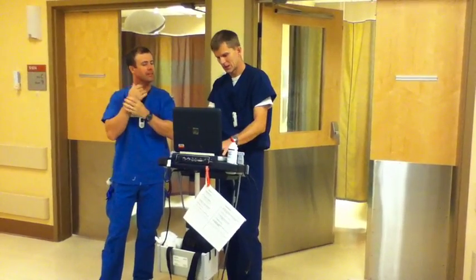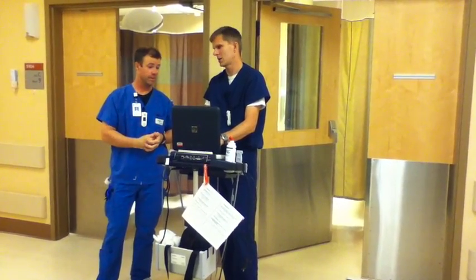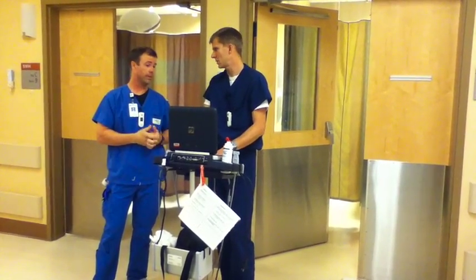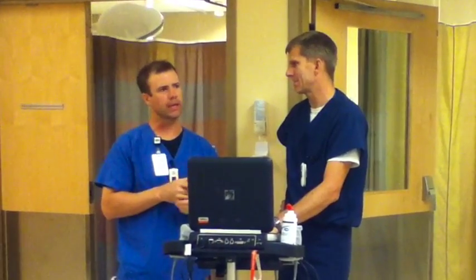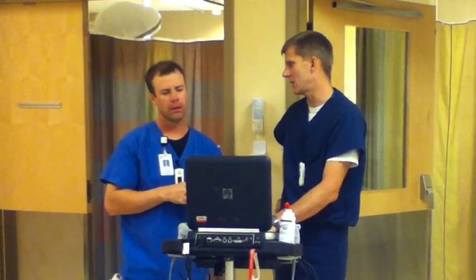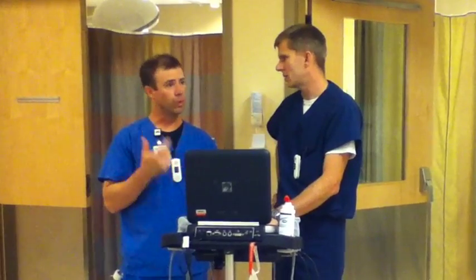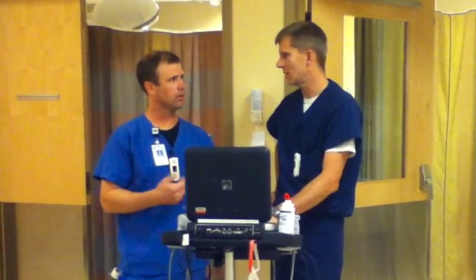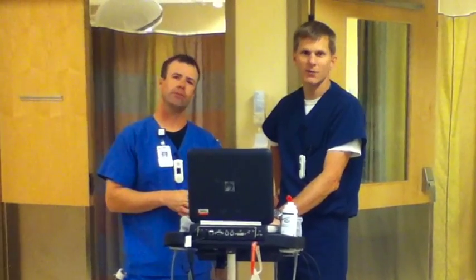How's it going today? I was just noticing that a lot of nurses know how to put in IVs, but don't know how to use ultrasound. Funny, because a lot of physicians know how to place ultrasound-guided IVs but have no clue how to put one in without an ultrasound. It would be good to have a tutorial on placing an IV both with and without — a guide for everyone.